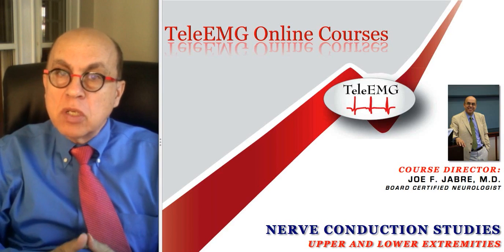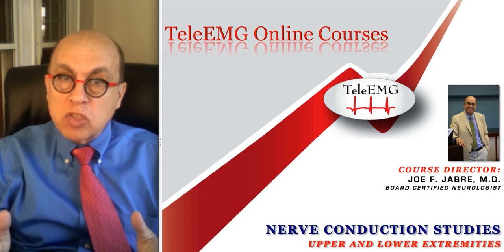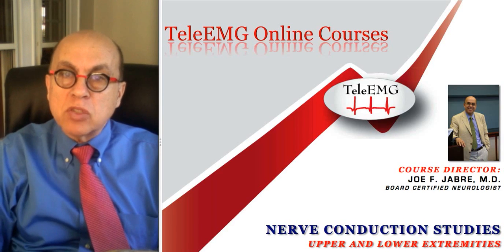In this section, we will cover nerve conduction studies in the upper and lower extremities. I'm Dr. Joe Jabre. I'm a neurologist, and I specialize in EMG and nerve conductions.